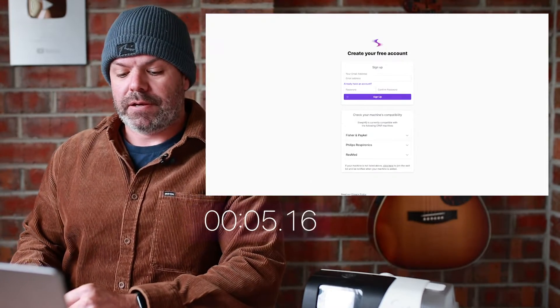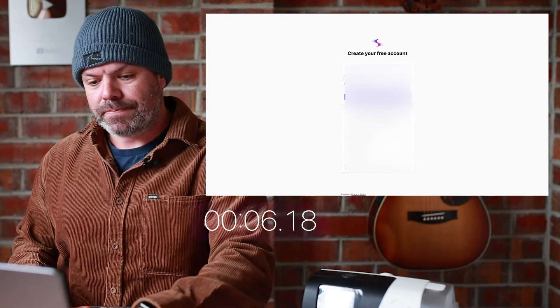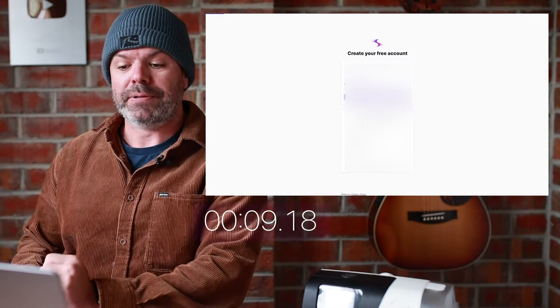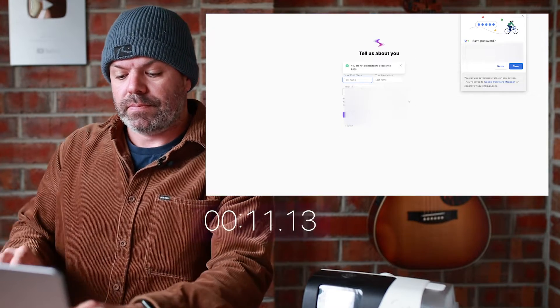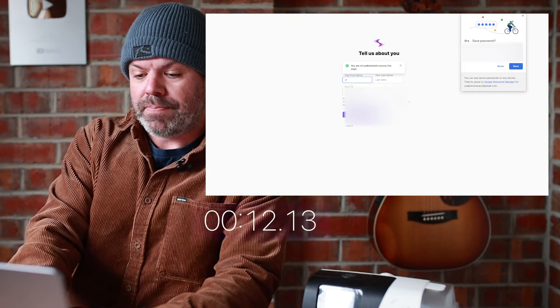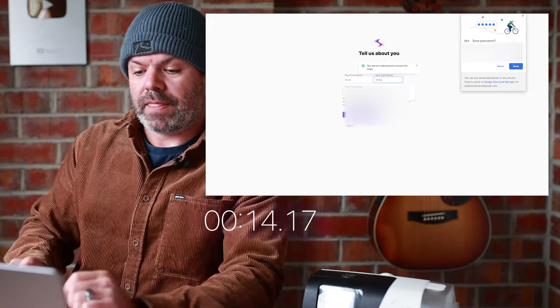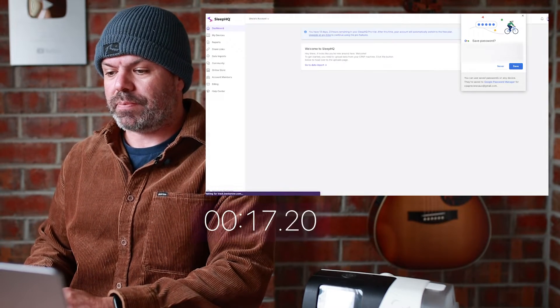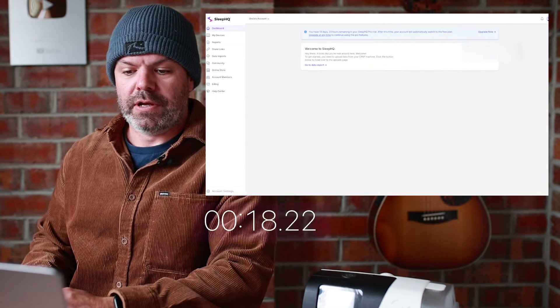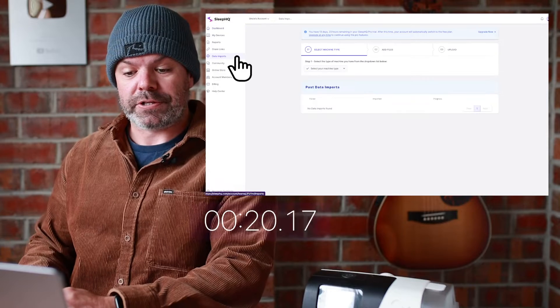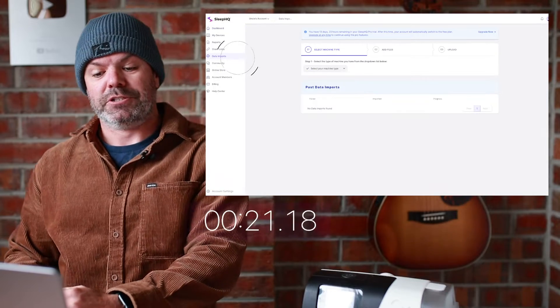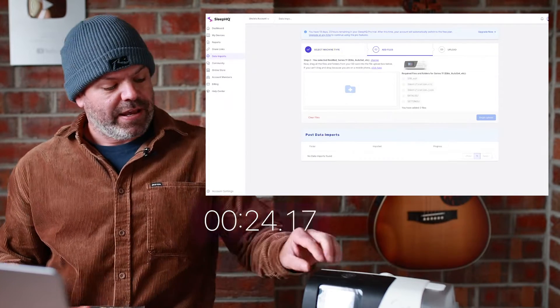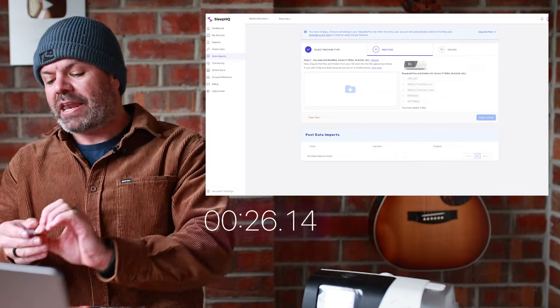Put in your email, create a password, click sign up. Put in your name and your time zone, click next. Dismiss any Google pop-ups and go to data import, then choose AirSense 11 SD card.